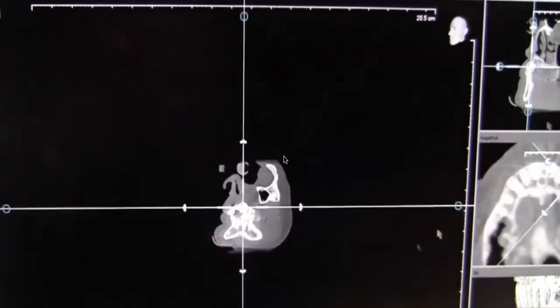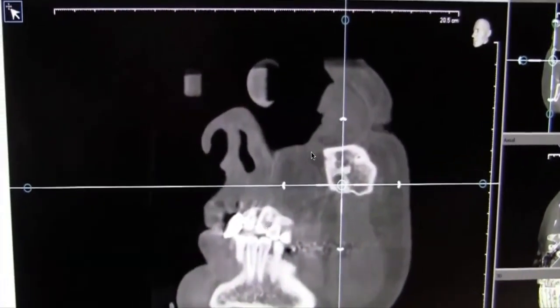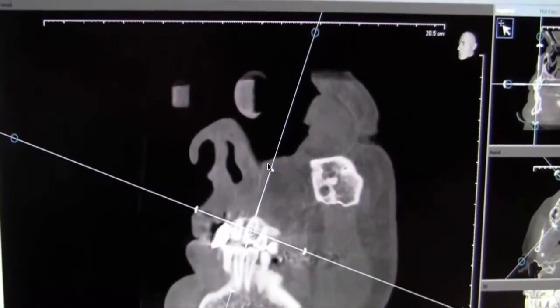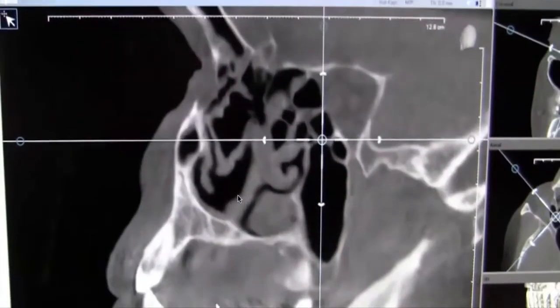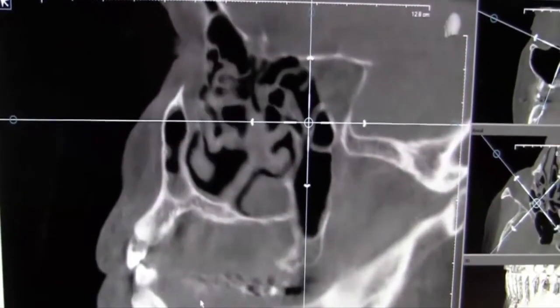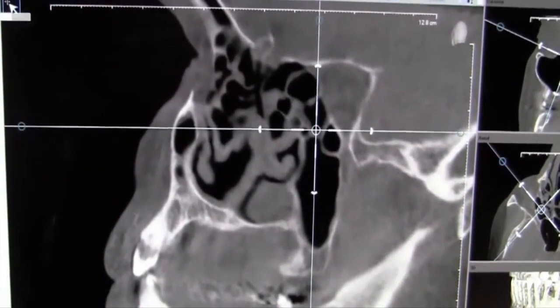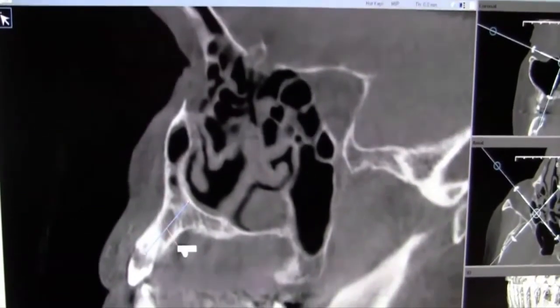The procedure that you can observe over here, it's called oblique slicing, and in the oblique slicing we can actually utilize these lines of the scan and put them in such a way that we can follow the actual axis of the tooth, and therefore we can obtain excellent images and excellent slices that are pertinent to the tooth itself. So you have total control on the way that you do your slice.